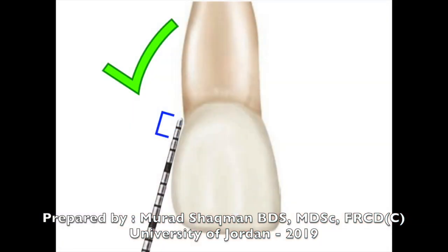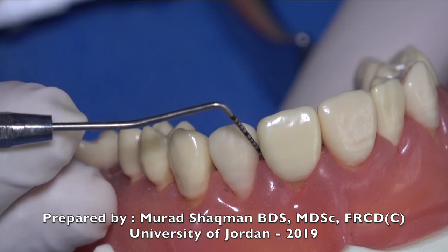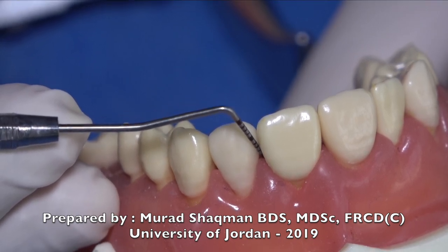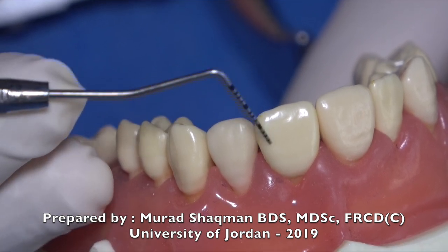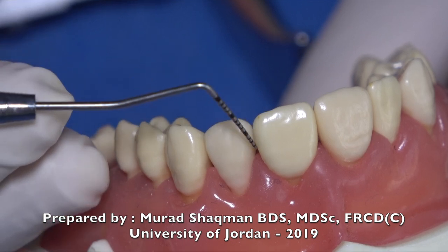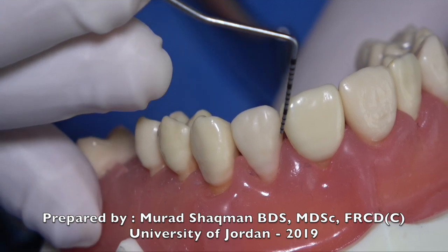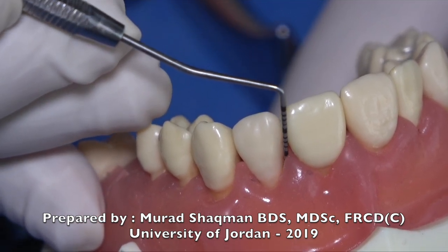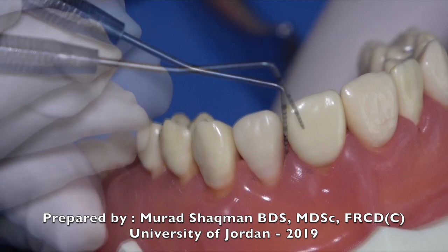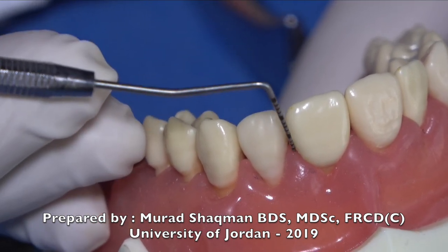You keep the first two millimeters of the probe flat on the surface you're probing and you slide the probe along that surface. When you want to switch from probing the distal of the central to the mesial of the lateral incisor, your probe is supposed to go out, tilt, and then go into the sulcus on the mesial of the lateral incisor. Don't maintain the same angulation and probe everywhere — that's not good technique.